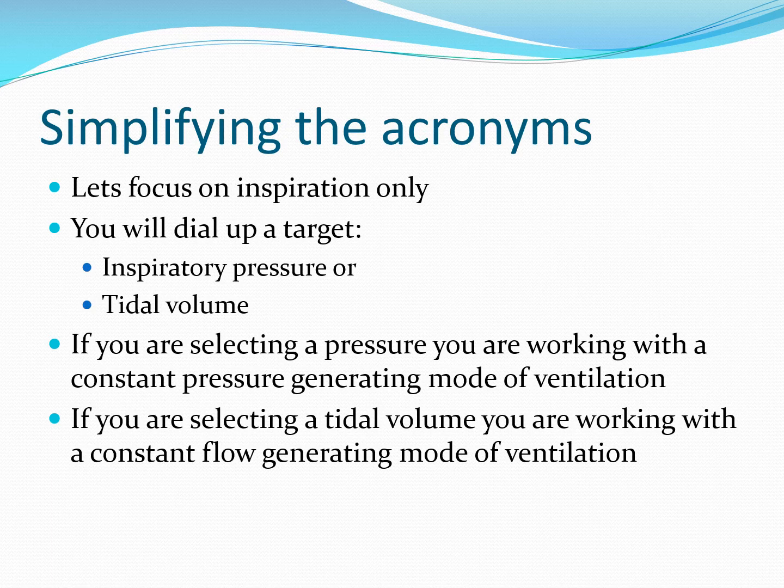If we focus on inspiration only, you're dialing up a target inspiratory pressure or a target tidal volume. If you're selecting an inspiratory pressure, you are by and large working with a constant pressure generating mode of ventilation. And if you're selecting a tidal volume, you are working with a constant flow generating mode of ventilation. Now, as with everything, there are exceptions that prove the rule here. And in this case, you can have a constant pressure generating mode of ventilation that will give you your dialed up tidal volume, so-called pressure control ventilation with volume guarantee.